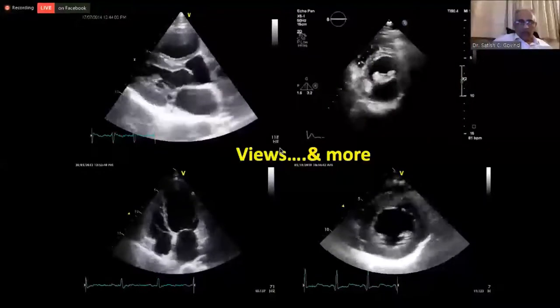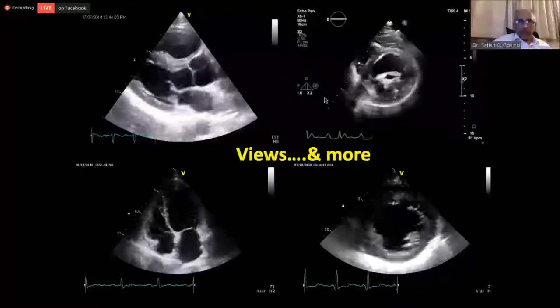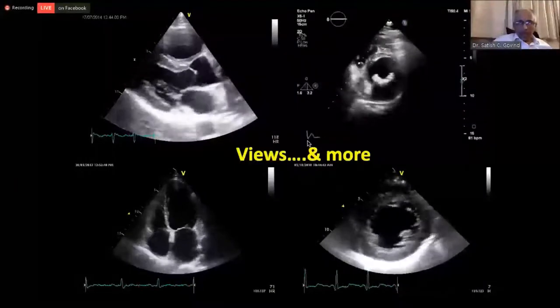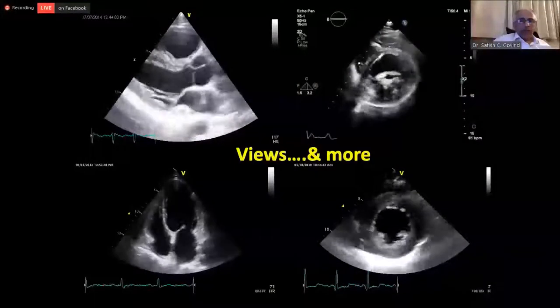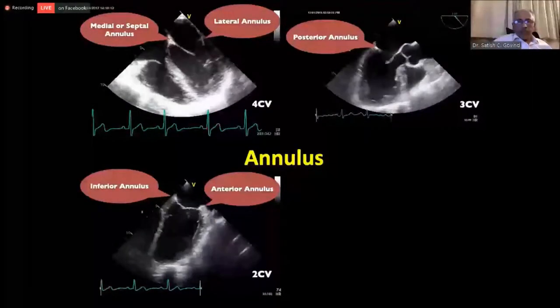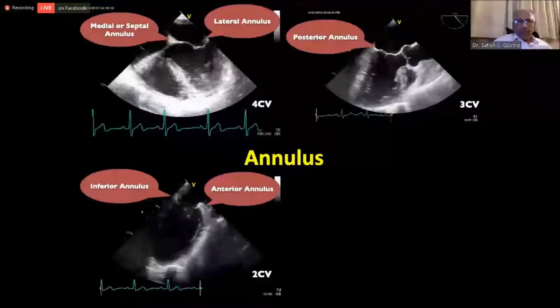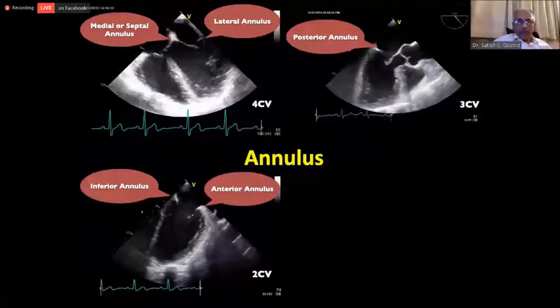So the mitral valve especially is a very, very echo-friendly valve, and that is why you get some excellent images in these standard views. Now, I'm switching to TEE. These images are intuitive, almost like the transthoracic. So let's look at how we can piece together the anatomy here.